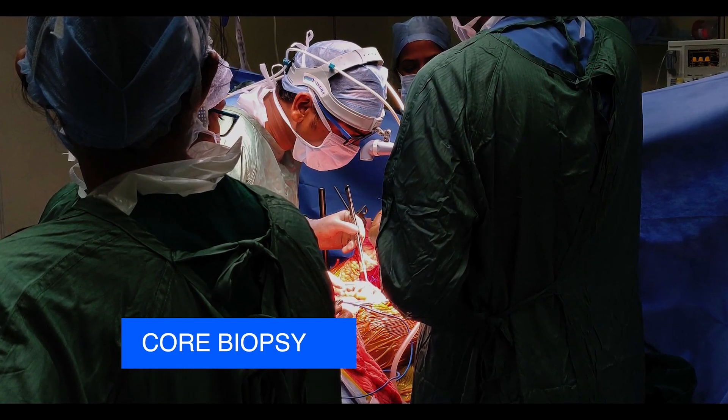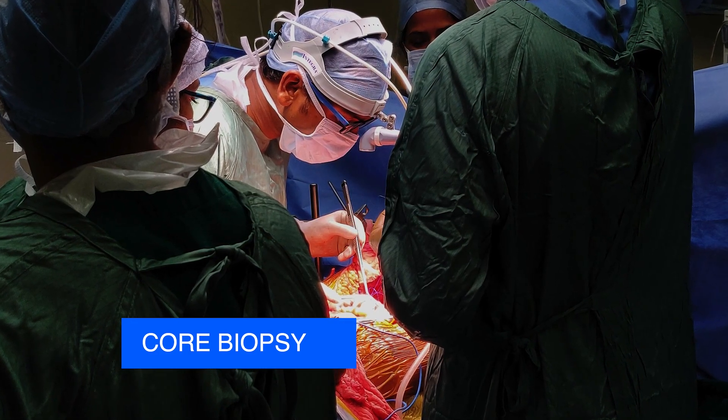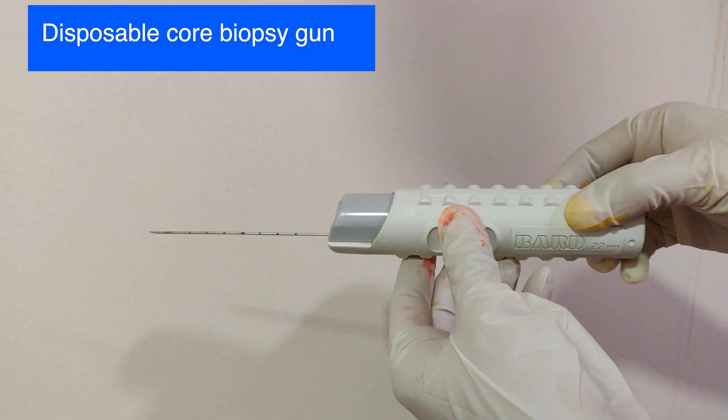Hello everyone. In this video, we will see how a core biopsy is done to diagnose cancer. Before going into the procedure, let us see how a core biopsy gun collects the specimen.